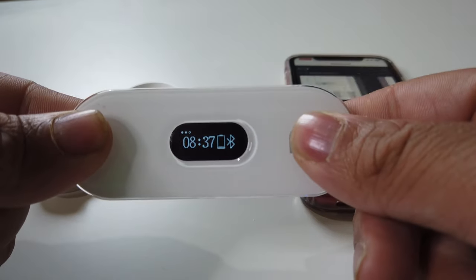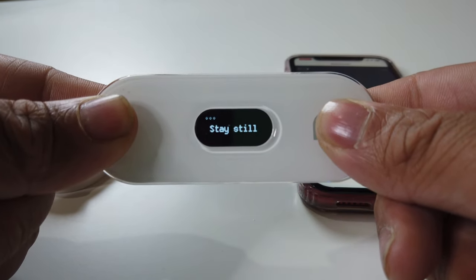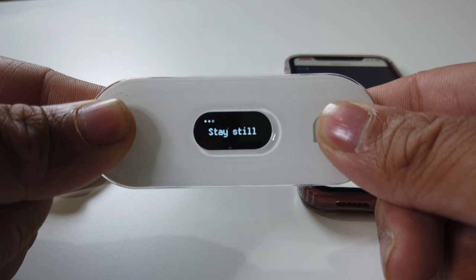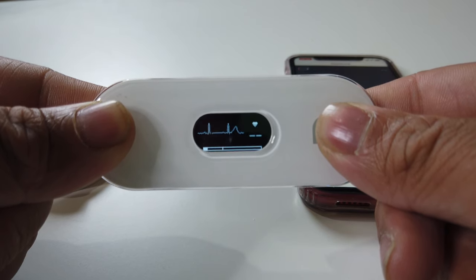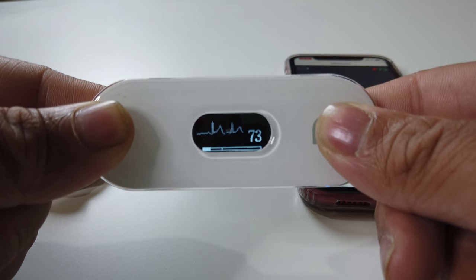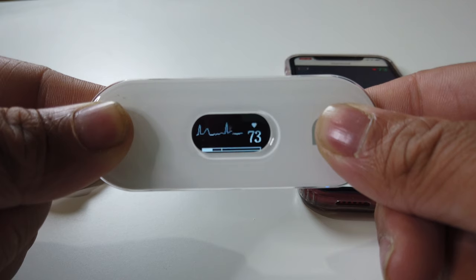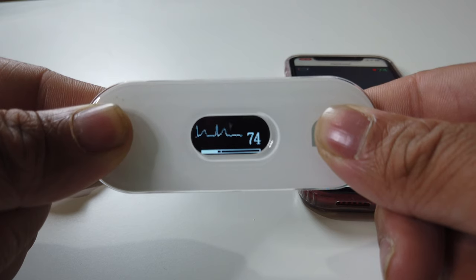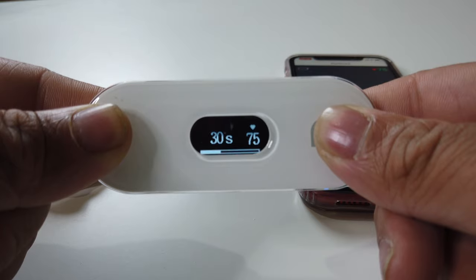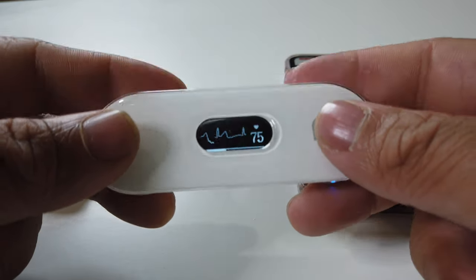Now if it's a normal reading it should just be smooth sailing just like this — it'll say stay still, you'll place your index fingers on there. Like I said, you can use your left leg and your right index finger, or put this on your chest as well. After 30 seconds, once everything is settled, it'll show you that you have a regular reading and that's it. You're good to go.